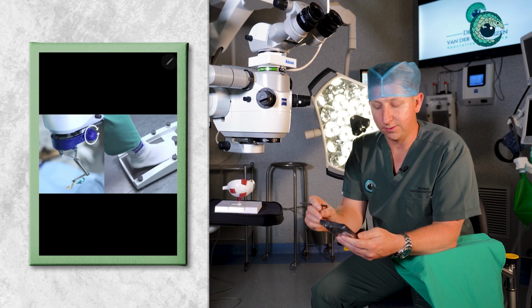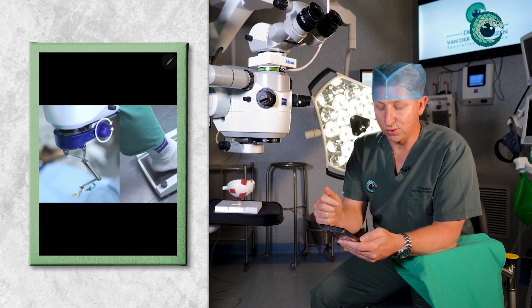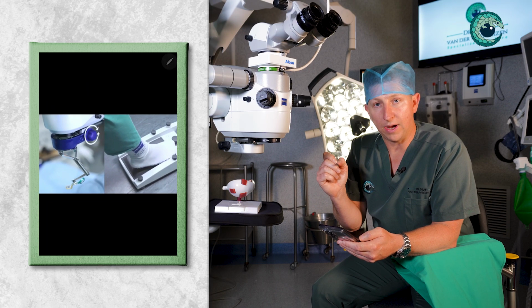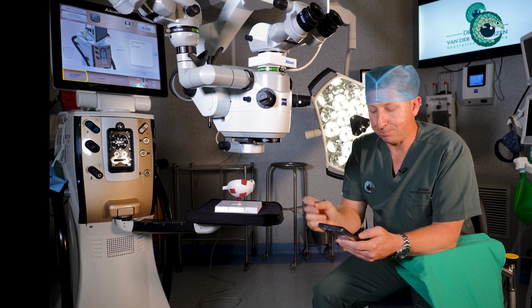So this is the Resight system. There are different lenses that can be placed above the eye, allowing us to get a view of the back. We can control it both on the foot pedal or via a dial on the microscope. So we can change focus and see what we're looking at at the back of the eye.